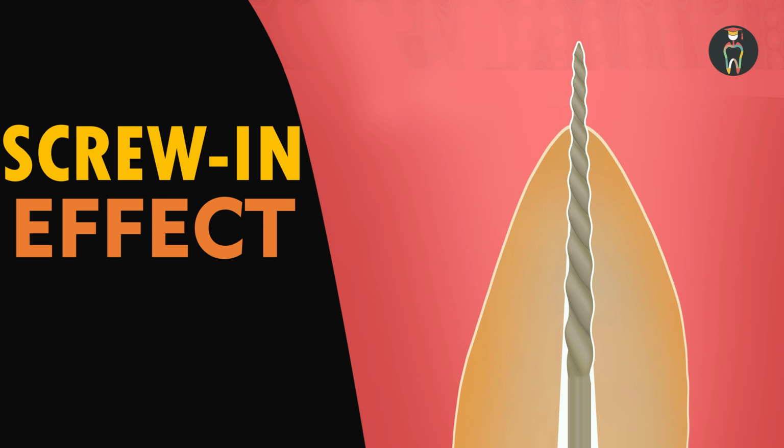Choose a file which fits better for you, and before choosing a file, always make sure about the design. We often choose a file based on how many times it can be used, the cost of the file, or whether it is a conventional file or a controlled memory file. But I would say it is better to pay more attention to the design. What is the taper of the file?